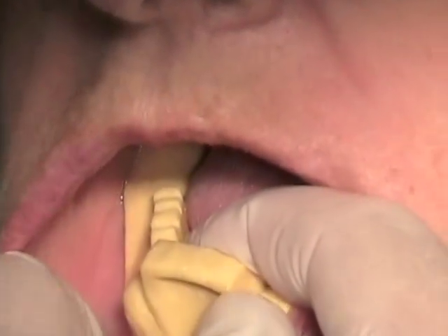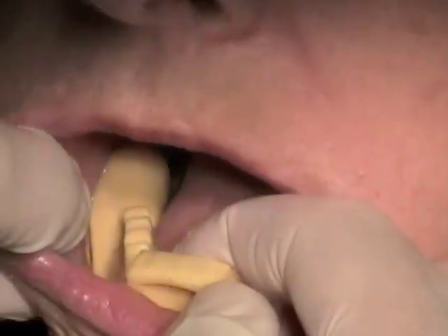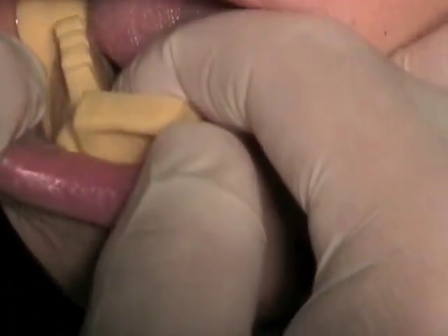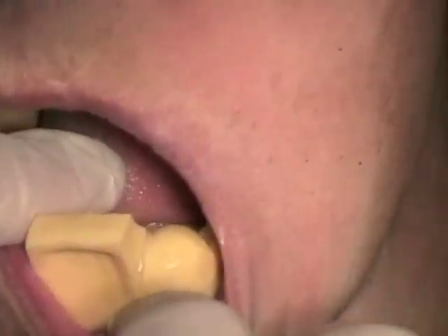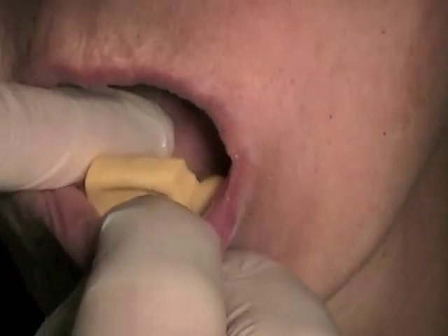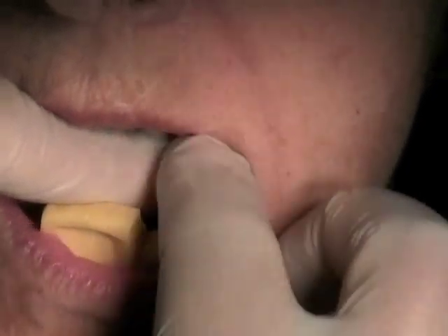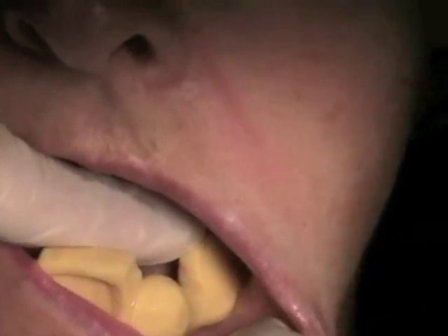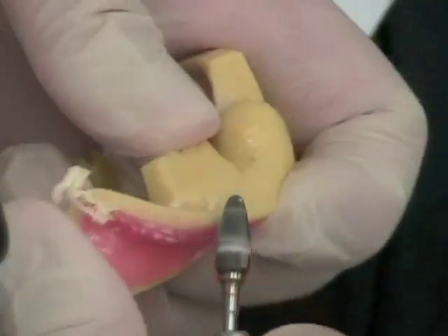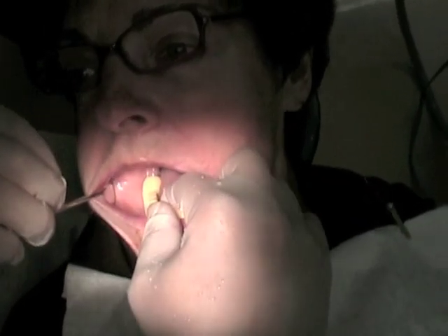In the mandible, the procedures are much the same. First we would start by adjusting the custom tray, pulling on the lips and cheeks and making sure that the tray doesn't pull up as we make functional movements. We would try that on both sides and in the anterior vestibule to make sure there is room for the labial frenum. Once we are happy with the extension of the tray, we would start the border mold. If there are any overextensions, we will take the tray out, take a burr, and trim to make sure the tray stays in place without movement.